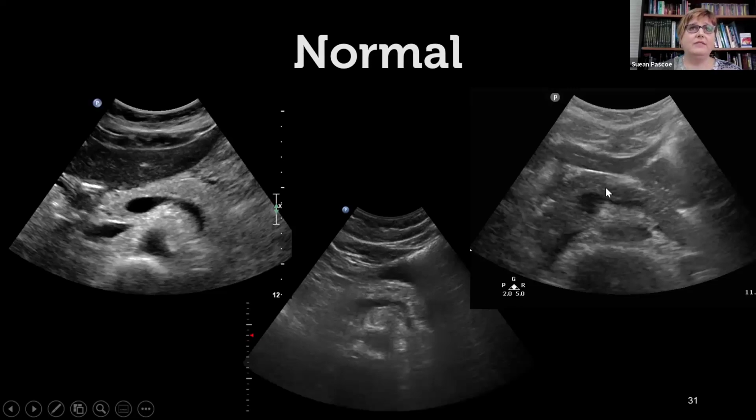And if they have some fatty infiltration of the pancreas, it can be a little more echogenic. It's described in the ultrasound books as a tweed-like echo texture. And I know when my mentor was saying it's that tweed-like thing, I had no concept of what tweed looked like. So I don't know if that helps you so much, but that was what was imprinted for me when I was learning.